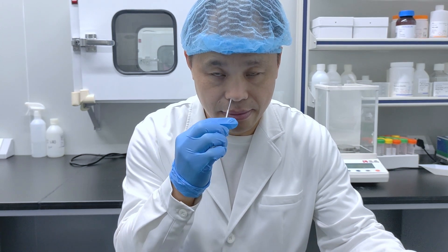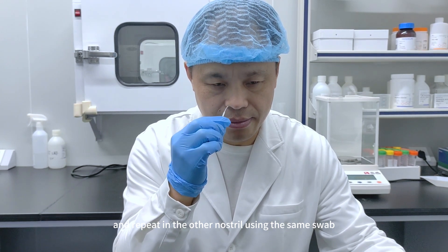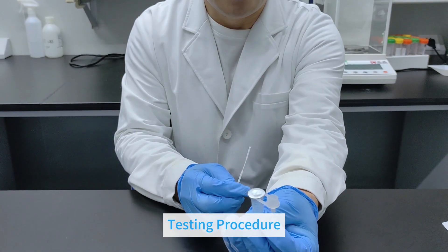Step 3: Rotate the swab several times against nasal wall and repeat in the other nostril using the same swab. Testing Procedure.